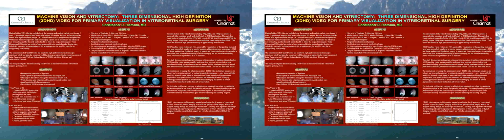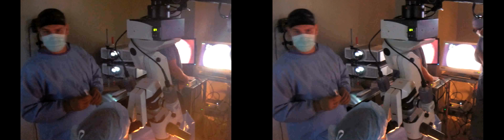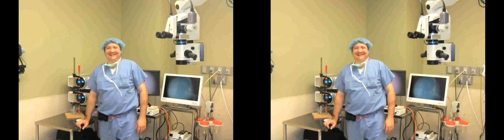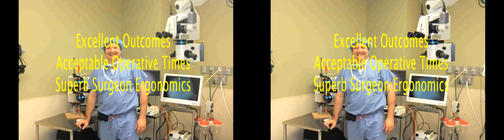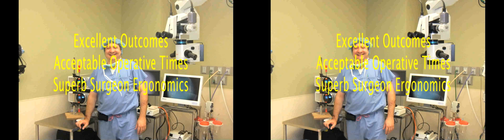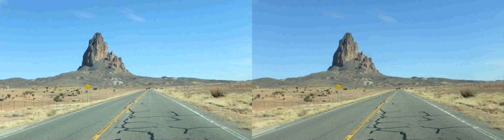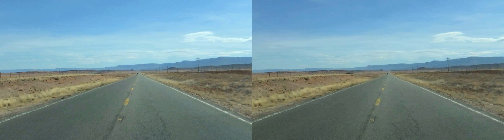Proof of concept data demonstrating the equivalency of 3D HD machine vision for primary visualization during vitrectomy surgery goes back to 2010, when we first presented a series of heads-up surgeries at the AAO using an early iteration of the TrueVision system, as well as a self-built system using 2 Optronics cameras, my personal home theater 3D projectors, and a portable daylight silver screen. Anatomic and visual outcomes were excellent, operative times were acceptable, and surgeon ergonomics were superb. Equivalency was established.